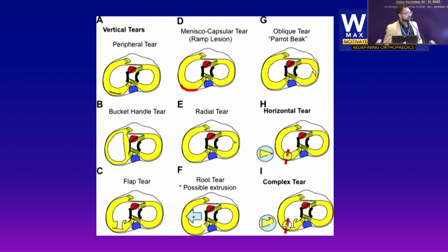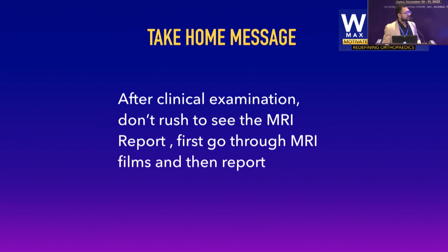So in short, we have seen all the meniscus patterns and tears, how they tear. So my take home message is, after clinical examination, don't rush to see the MRI report. First go through the MRI films and then see the report. Thank you.